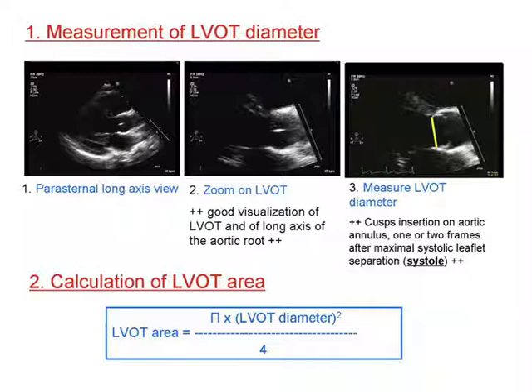So to measure the cardiac output, the first thing you do is measure the diameter of the left ventricular outflow tract. And you can see that in the parasternal long axis. So first thing you do is go back to parasternal long. Remember that? That's the RV up here, the LV over here, the LA is here, the mitral valve is right here, and then the blood comes into this LV, and it gets pumped out this aortic outflow tract.